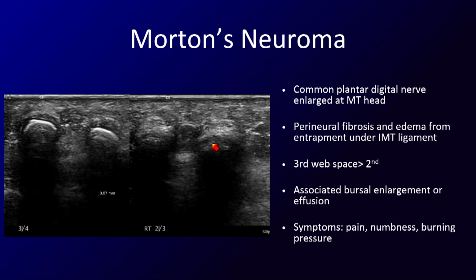Many times when I'm imaging these, I'm compressing from the dorsum of the foot against the transducer, which is on the plantar aspect of the foot. And the patient will say, you're actually pressing what hurts. So there's a lot of confirmation when you're doing this.